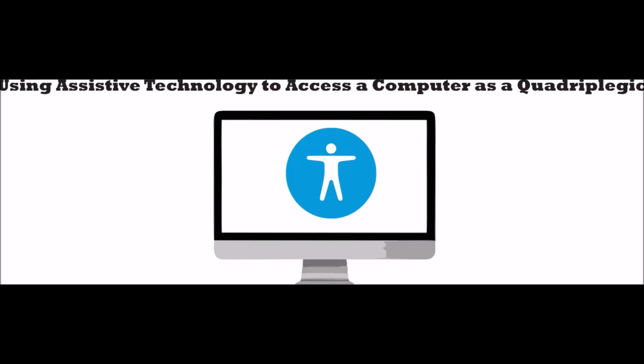Well, I'm going to start with the most important thing, which is being able to browse the web and basic typing. When it comes to typing and browsing the web, I use a program called Dragon Professional Individual 15.0. The reason that I use Dragon to do all my typing is mostly due to how easy it is to create custom commands for things such as my email signature. My email signature only consists of 4 lines. I can create a custom phrase to type the whole thing just by saying insert my email signature.